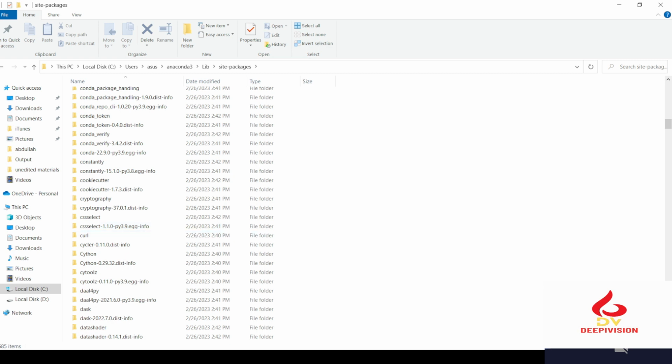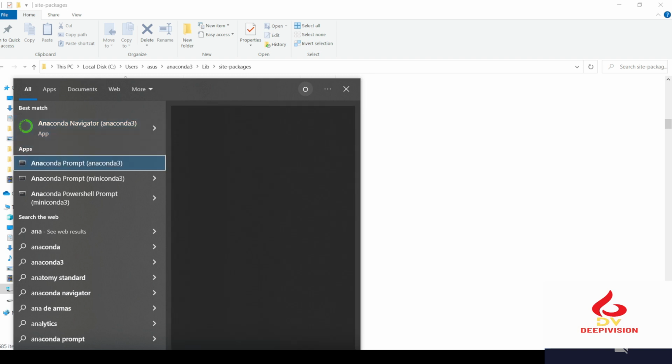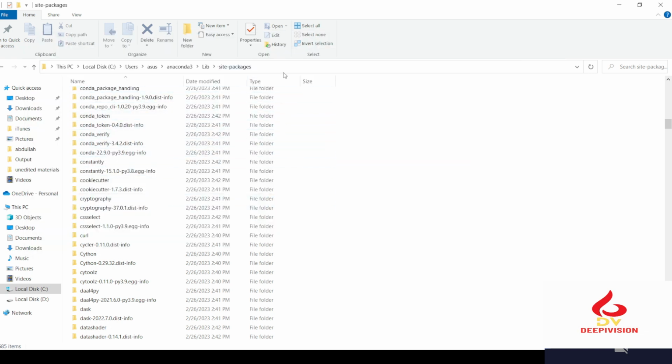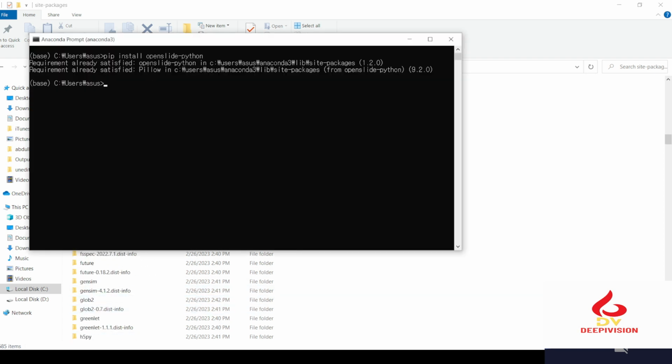Before coming to here, you need to install openslide-python. Okay, requirement already satisfied. So in my case, it is already installed. For newcomers or new users, you need to install this first, then do this. Site-packages. Here you can see openslide. When you install from here, it comes here.